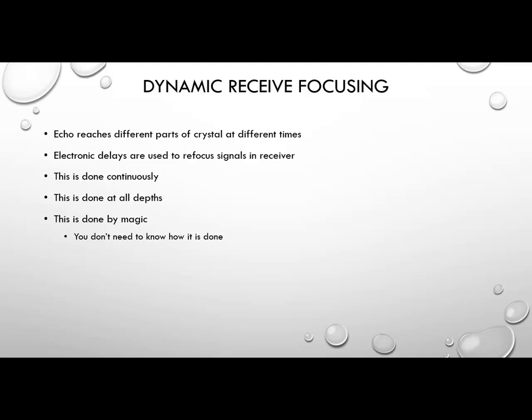If you really want to know how it's done, there's an article by Dr. Kremkow in the Journal of Diagnostic Medical Sonography called The Changing Paradigm of Ultrasound. It goes through this entire dynamic receive focusing thing. Believe me, all you need to know is it's magic. It's done by the manufacturer, but the points you do need to know: it's called dynamic receive focusing, and it's done continuously, and it's done at all depths. Okay, and unlike transmit focusing, receive focusing does not slow down our temporal resolution.